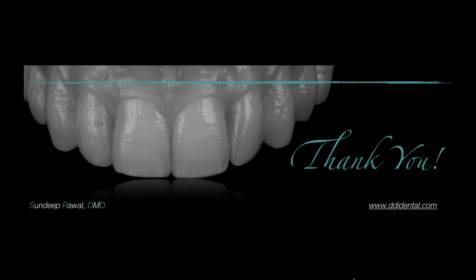Way one is called camera-based navigation, which is what you see with a system like XNav, where you have real-time tracking of your handpiece that you can see in augmented reality, so that you can look at a screen, see where the handpiece and the drill is and the implant with respect to what's going on in the mouth in real time. You can know where you planned the implant, and you can place the implant based off of that in augmented reality.